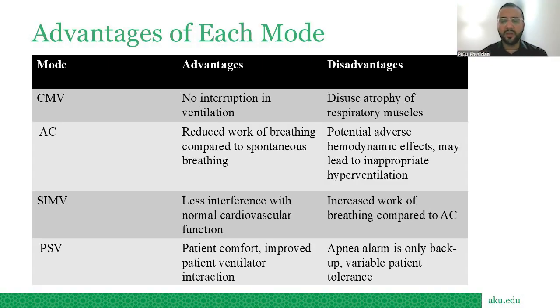So this mode has an advantage that it creates less interference with normal CVS function, but the disadvantage can be that if the patient is not prepared for spontaneous breathing, that will result in increased work of breathing.